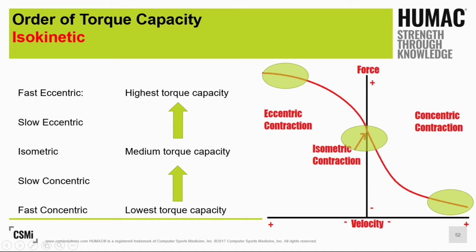Now with isokinetics, another unique way we can progress the patient is by having them increase the percentage of effort they give. Since the machine accommodates, they can start off with minimal force production, say 25% effort. And as they progress, we can then increase to 50% effort, and then 75 or 75+% effort as the weeks pass. So we have a lot of different options available to us on isokinetic machines that you don't with the functional isotonic exercise.